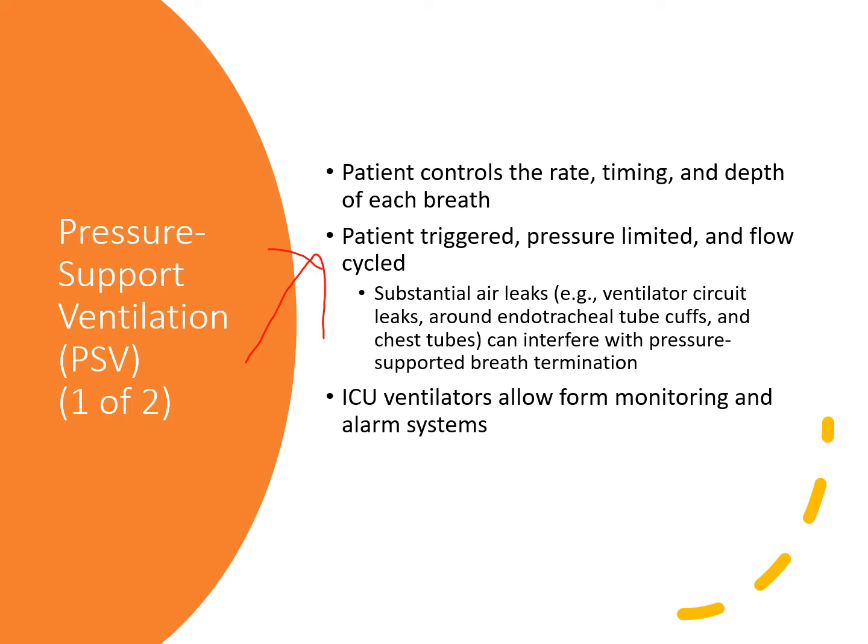So you can titrate the pressure support appropriately for the right size tidal volumes and the right size minute ventilation as well. But really the most practical method of establishing the pressure support level is based on the patient's airway resistance. So you're like, Derek, how do I decide what pressure support to put someone on when we go into spontaneous mode?